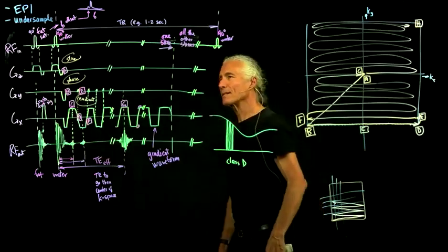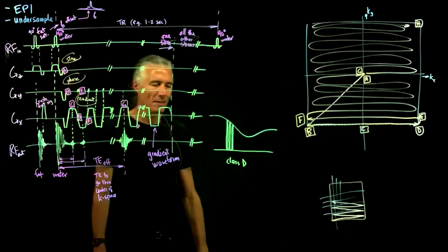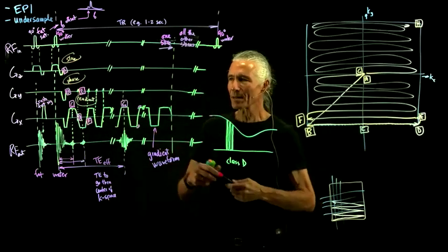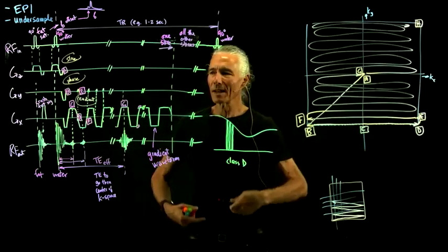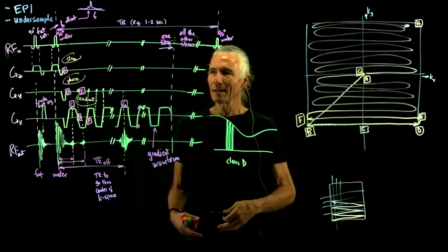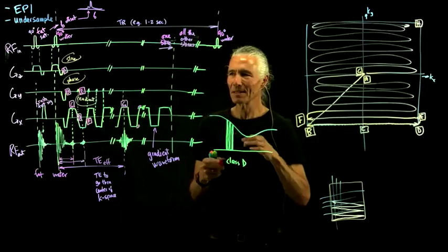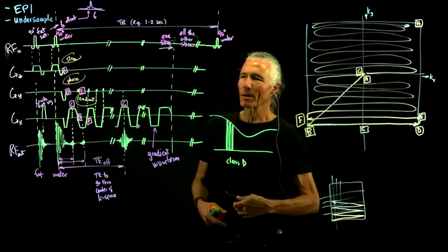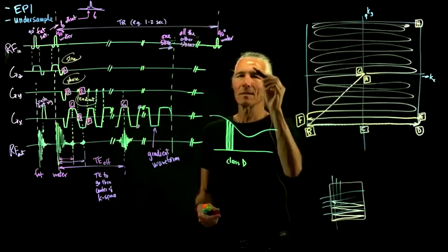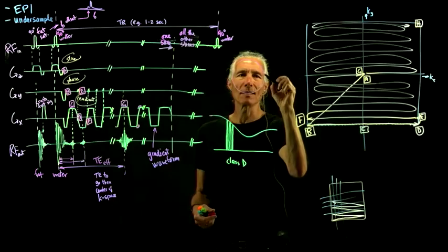You often do it in some of the other sequences. I didn't talk about it in other sequences, but it's not uncommon to do it. It's particularly important here because it depends on how much fat, what are you recording? If you're recording a muscle, maybe it doesn't have much fat in it. If you're recording an old person's muscle, more fat in it. So it's kind of variable. Or if you're recording some part of the stomach where there's a lot of fat, then it's going to cause more trouble. Here, the reason it causes trouble is because you've got this little layer of fat under the skin.